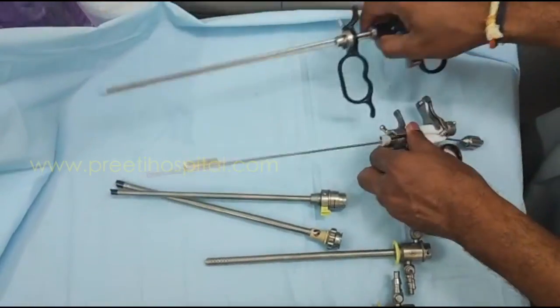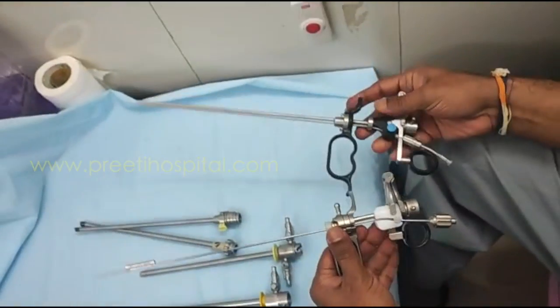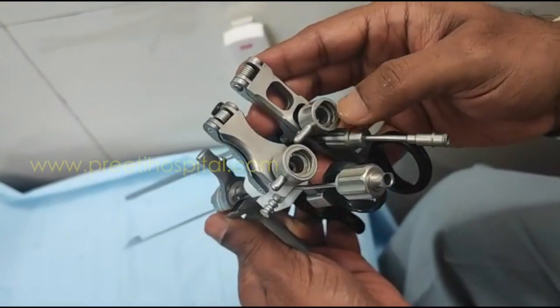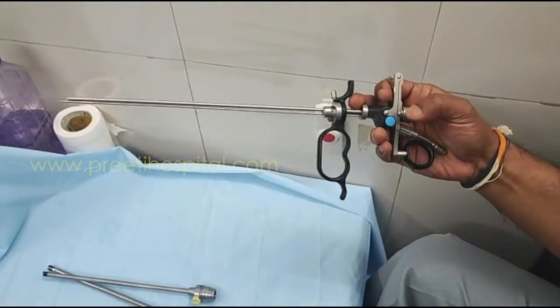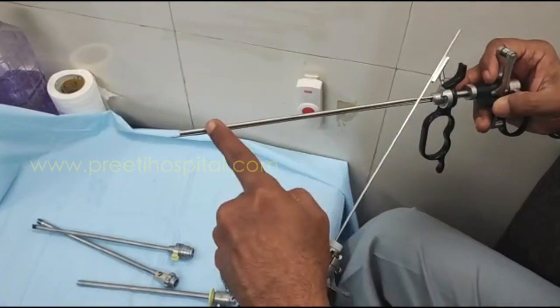Coming to the working element: this is a standard working element — both are actually the same working elements, except for the telescopic hole, which is almost the same. But for the telescope, this is RK Medical and this is Storz. Here they have given a separate telescope channel.